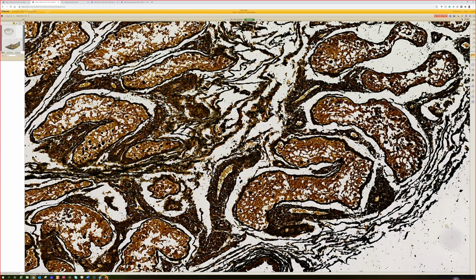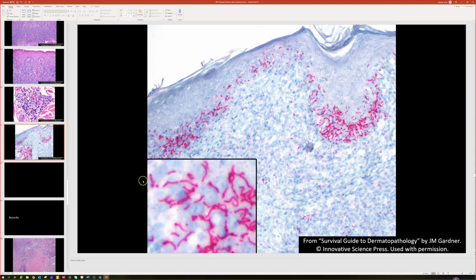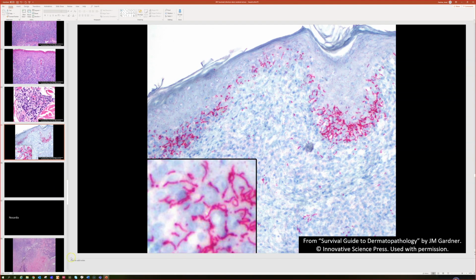Now, let me show you the spirochete immunostain. And not everyone is lucky enough to have access to this, but this is what the spirochete immunostain looks like. No doubt about that, right? This is with a red chromogen. You can also use brown. Red sometimes has this little fine granular background that's nonspecific. Brown, sometimes the difficulty is telling apart melanocyte dendrites from the actual organisms. But look, right here along the basal layer, you're seeing numerous squiggly little linear spirochete organisms. And here's a close-up view to see that they kind of have that spirally, twisty shape. That is an example of secondary syphilis with a spirochete immunostain to recognize the Treponema pallidum organisms. Okay.